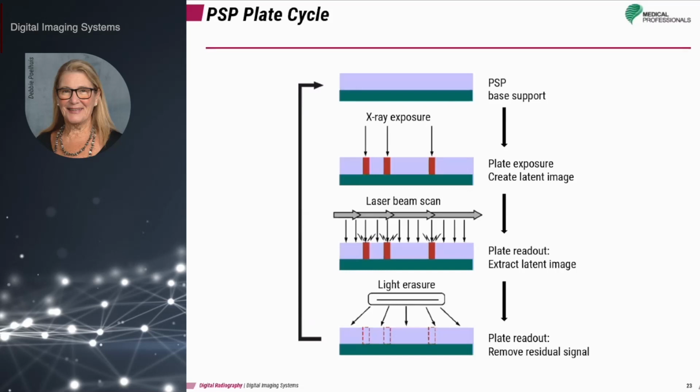Overexposed plates may need to be erased more than once because they will retain some of the previous energy. CR imaging plates are more sensitive to background scatter and should be protected prior to use, and erased if they have been stored for any length of time.